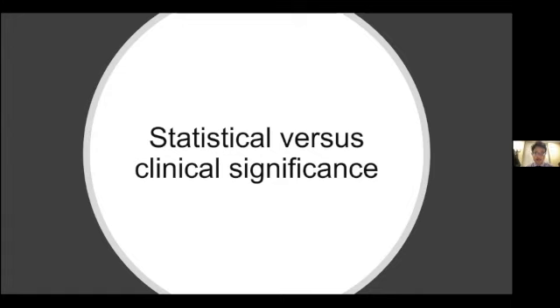On the flip side, in other parts of the world, like in parts of Europe and in China, the chest CT was actually used often as a diagnostic screening tool. As a result, an algorithm that's able to very rapidly and accurately help diagnose COVID-19 is able to make much more of a clinical difference in that kind of environment.